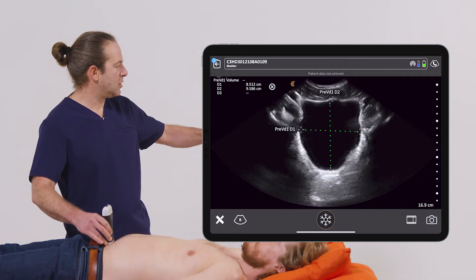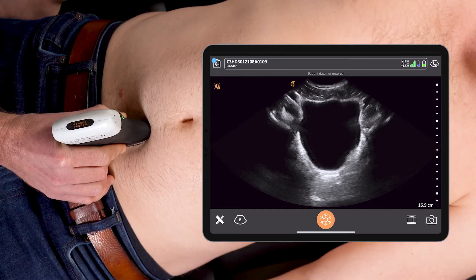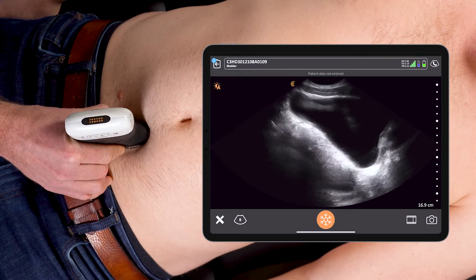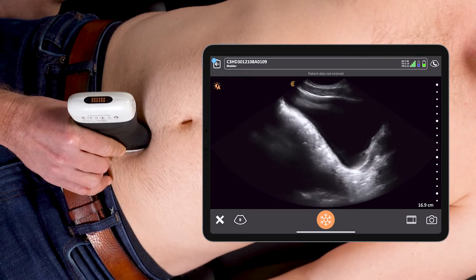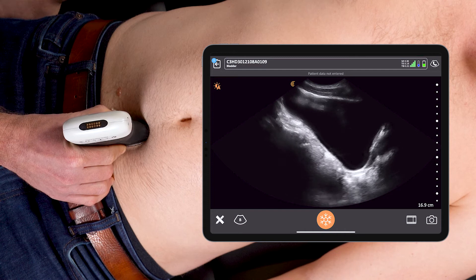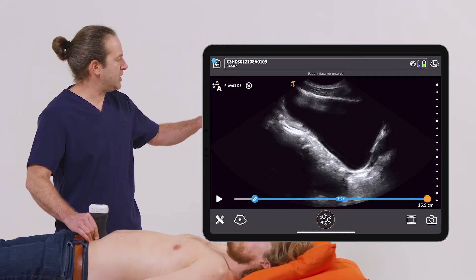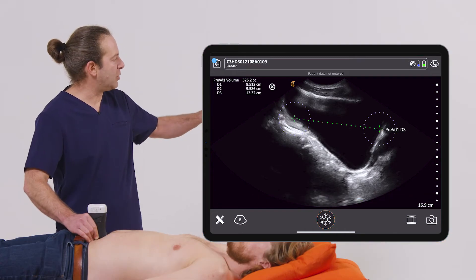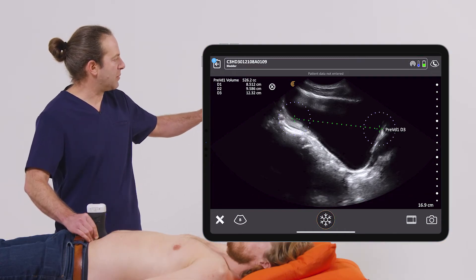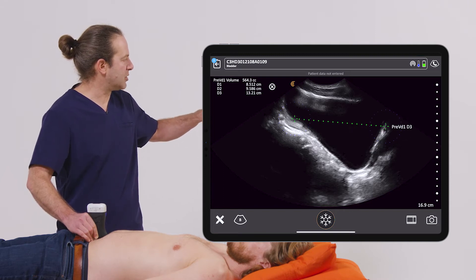I save that image, go back to scanning, now into the sagittal plane. I'll again maximize that diameter, and this time I just have to freeze and click on the bladder. Calipers will pop up and I can make sure they really go to that maximal extension.